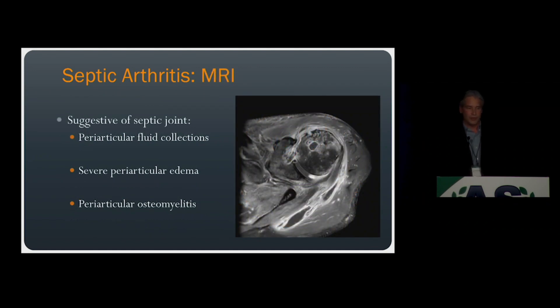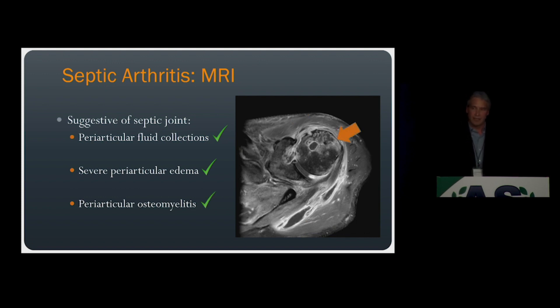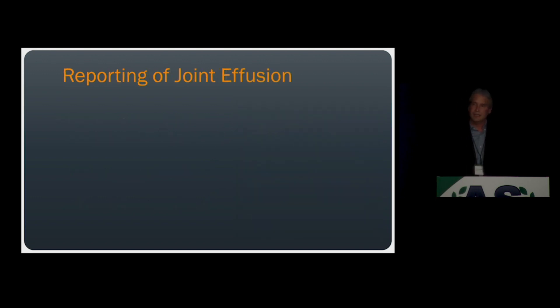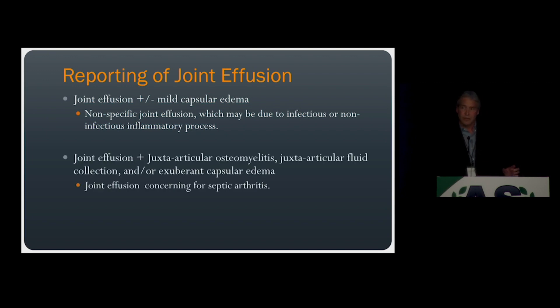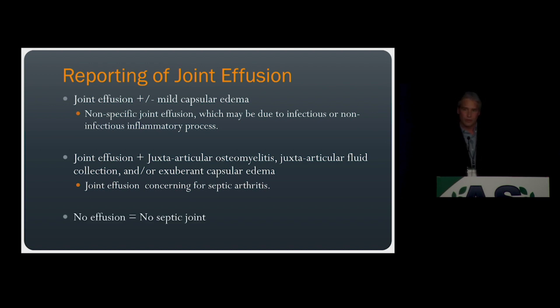Here's a shoulder MRI with suspected septic arthritis showing all three findings: periarticular fluid collections, severe periarticular edema, and periarticular osteomyelitis — placing this patient at high likelihood of a septic joint. When reporting, if there is a joint effusion with or without mild capsular edema, report it as a nonspecific joint effusion that may be due to infectious or non-infectious inflammatory process. If there is a joint effusion with juxta-articular osteomyelitis, fluid collections, or exuberant capsular edema, that is concerning for septic arthritis — though be careful not to call it diagnostic. And if there's no joint effusion, there's no septic joint.